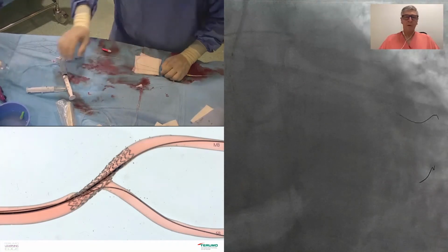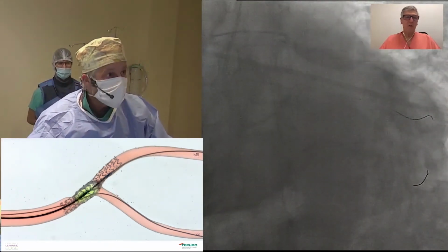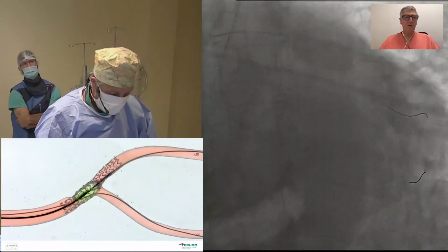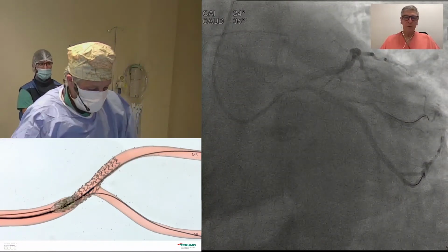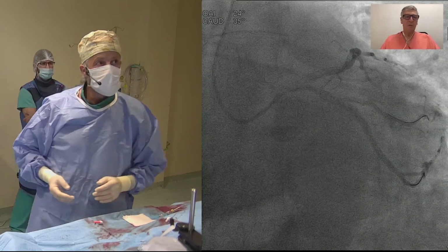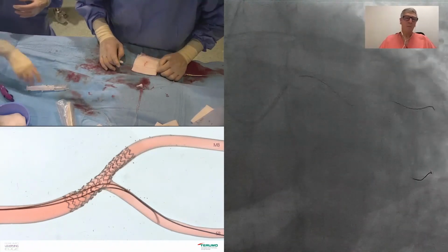So of course, it's very important to do the POT at the right place, up to the proximal part of the stent, but also very close to the carina because this is where you will access toward the side branch with the third wire. Sometimes you have to do several POTs in order to have an optimal apposition up to the proximal part of the stent. In order to cross, you have to be really pretty sure that you are not malapposed behind the stent. Then we go from distal to proximal.